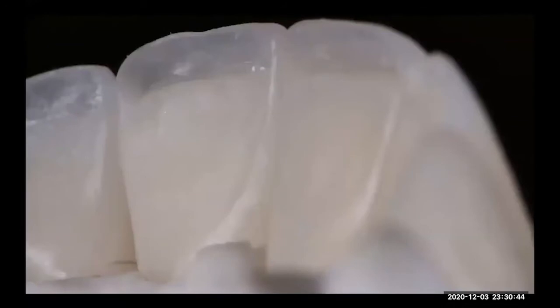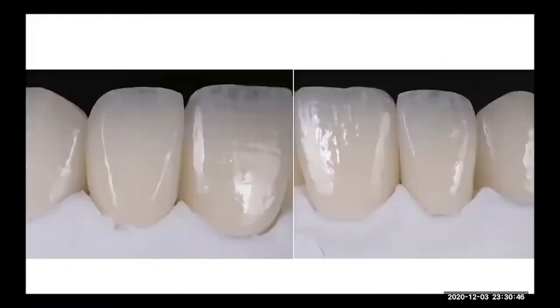You see, filling the concavity. You can see the translucency that we can create from palatal. It's really important that you work with a nice wax, because some waxes are more crystallized than the other ones. I found out that the Geo one is really soft, really nice.